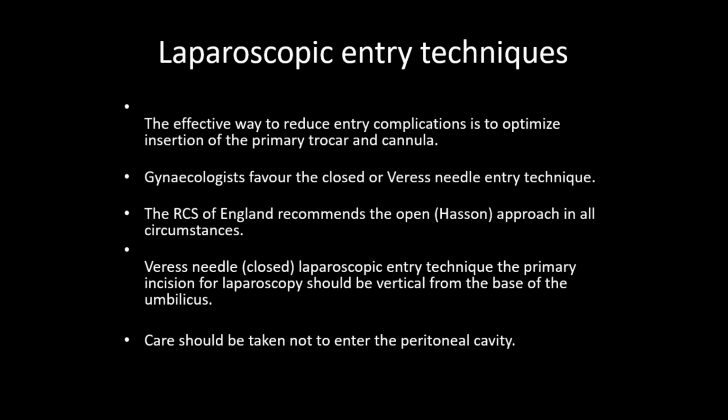The pressure will be decreased to 12 to 15 millimeter mercury, so that you can start at a lower intra-abdominal pressure, aiming to decrease the possible cardiopulmonary compression and the possible complications with high pressure. Okay, this is about the recommendations of entry.